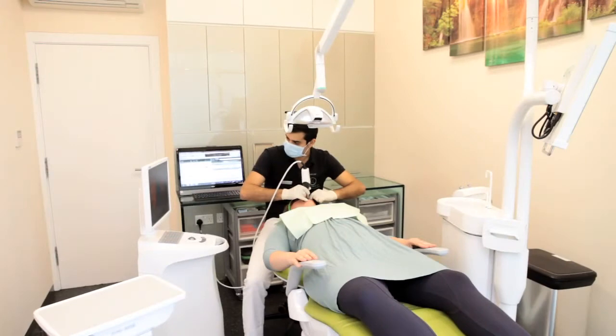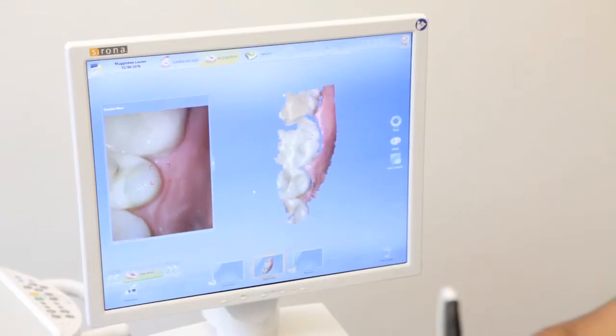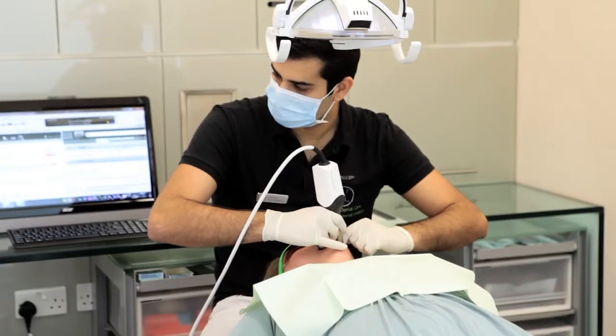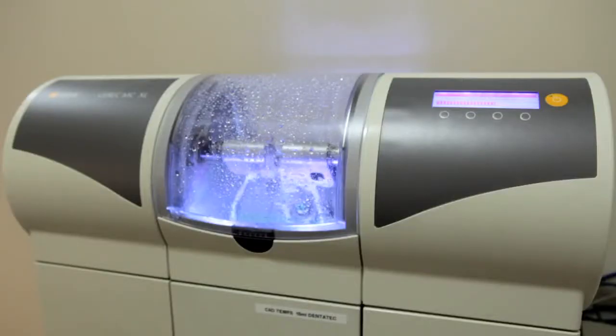When the patients first arrive, we freeze up the tooth and we prepare the tooth as normal. Then we take a digital impression and create and mold the tooth to give it the perfect shape, the perfect color, perfect height. Once we're happy with that, we get it 3D printed in our on-site milling machine.